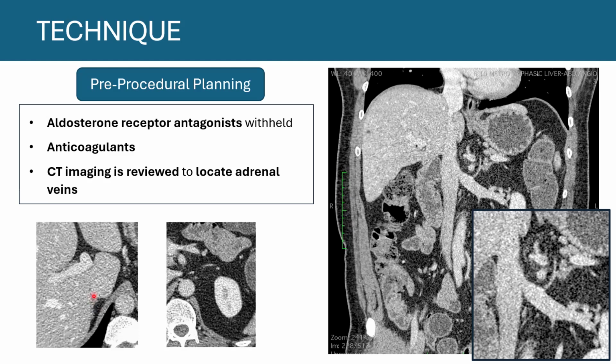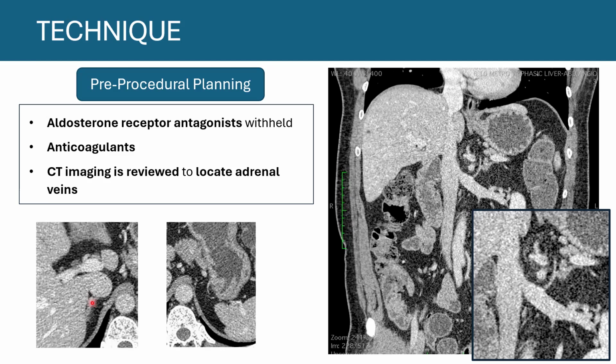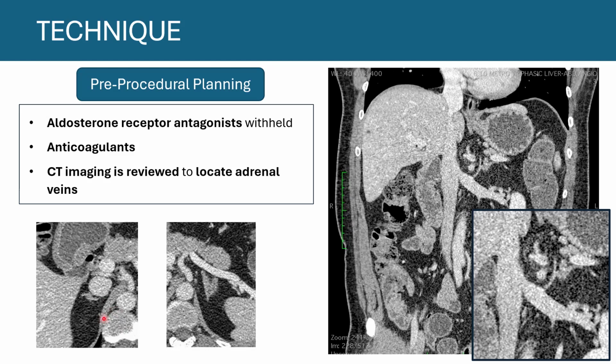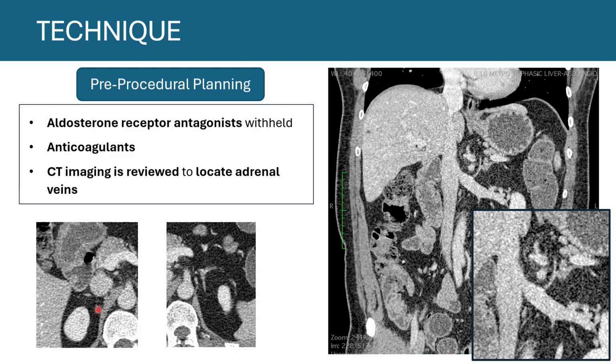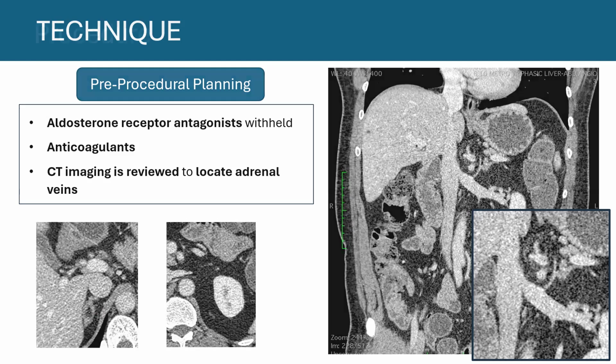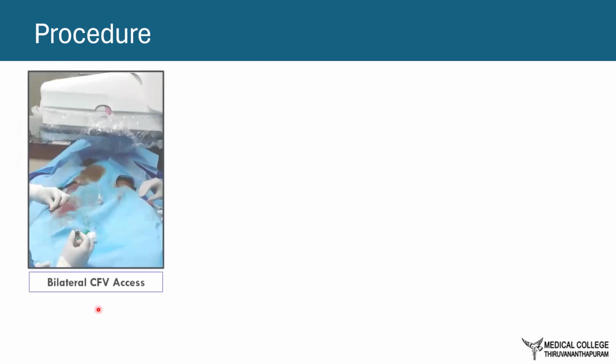So it's very difficult to be clearly delineated, but that connection from the IVC can be depicted, for which you need to look at the vertebral level. And whenever you're doing your angios, you do it depending upon the vertebral level that you have seen in CT. So you start searching one level above the one that is seen in CT. So this is how we generally do.